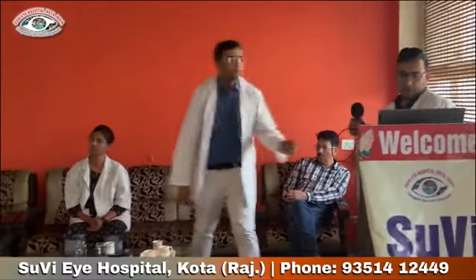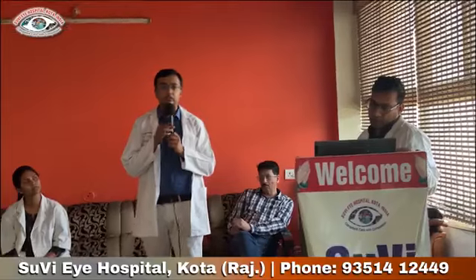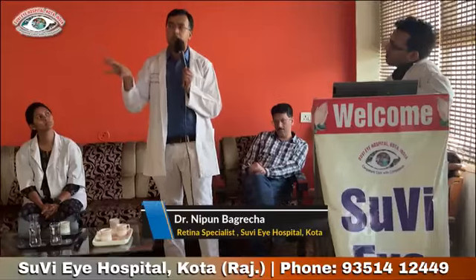Sometimes, if a dense cataract is there, instead of barrage... we had one patient with a dense cataract and multiple lattices with holes. So what we did was cryopexy to that area, and then we proceeded with the cataract surgery after 2 weeks of that cryopexy. So if the barrage is not possible, we can do cryopexy as well.